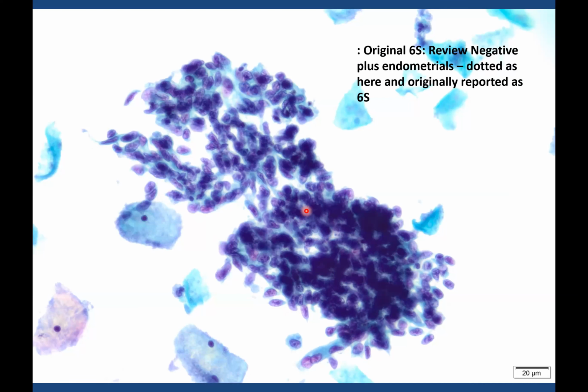But what I think we're looking at here are endometrial stromal cells which have lost their surface epithelium. So they look dark and hyperchromatic because these are coalescing in on themselves and going through apoptosis. And then when we go to the edge, you can see some of them have a more kidney bean shape, and with the eye of faith, you can imagine nestled over that these sort of curvilinear surface changes to these nuclei. So these are endometrial stromal cells.